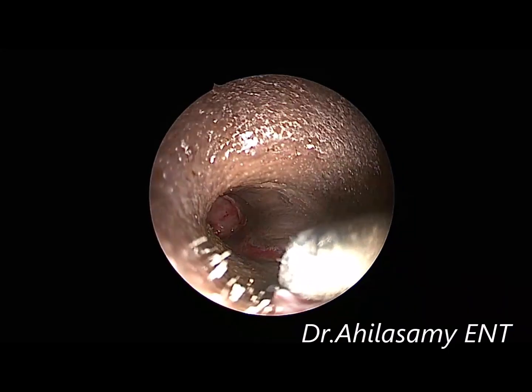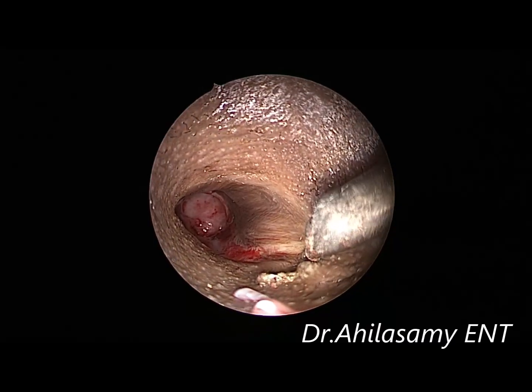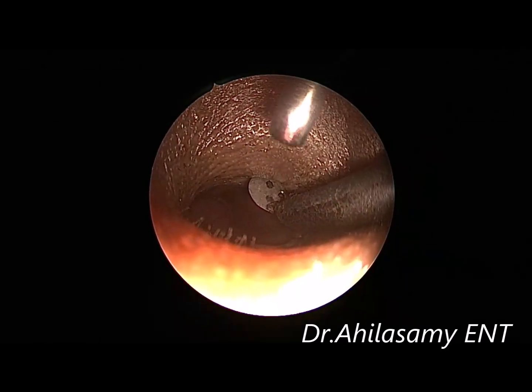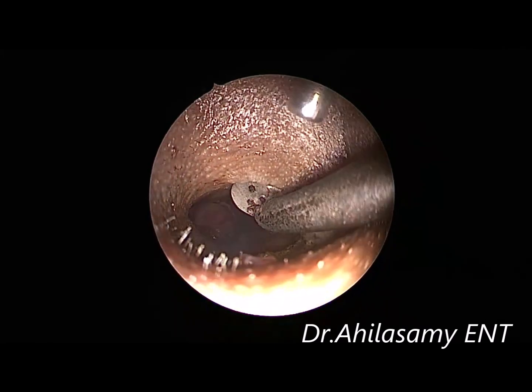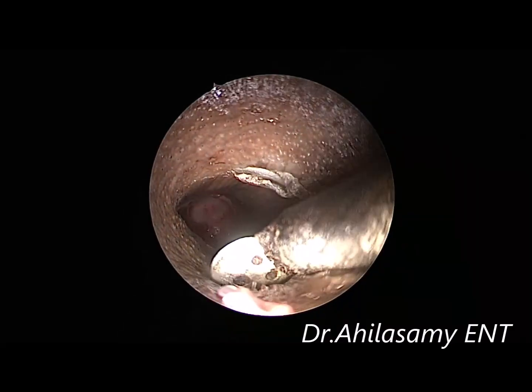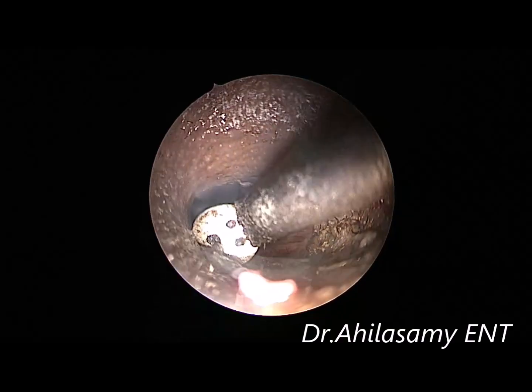Now I am using my own innovation, Dr. Agila's endoscopic diathermy round knife, to make the incision for the tympanomeatal flap. Use it at a very low power of 10 on the diathermy machine; otherwise the skin gets charred too much and there will be a lot of skin damage.